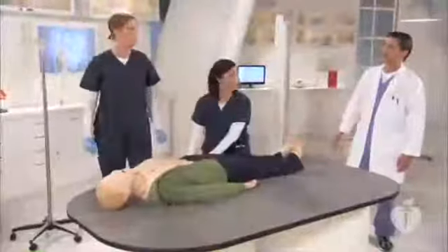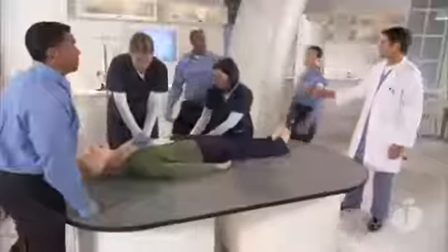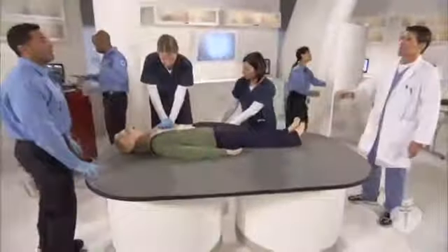Okay, let's call a code. The patient's gone into VFib. Start chest compressions. Starting compressions. Mandel, you'll be on defibrillator. Shelley, you'll be recording. Recording. Sam, you'll manage the airway. Dana, have you been able to establish an IV access yet? I've tried several times, but it's failed. Okay, let's move on to IO access, please.